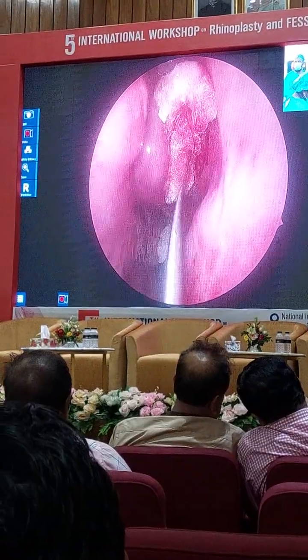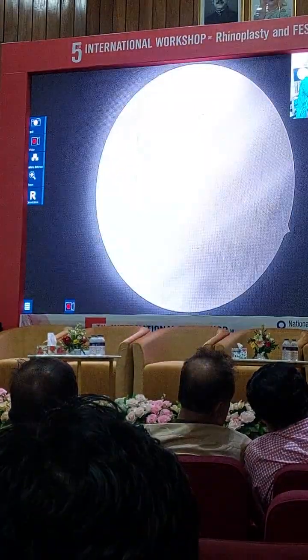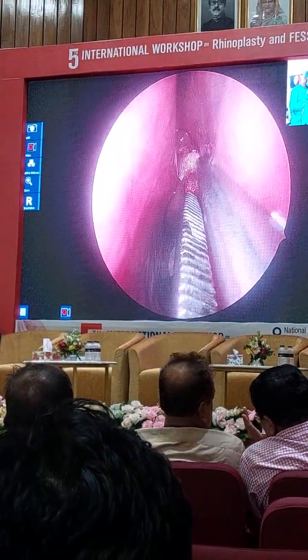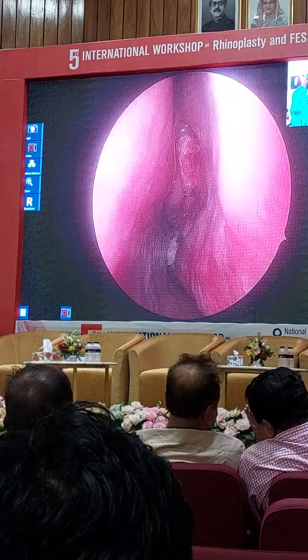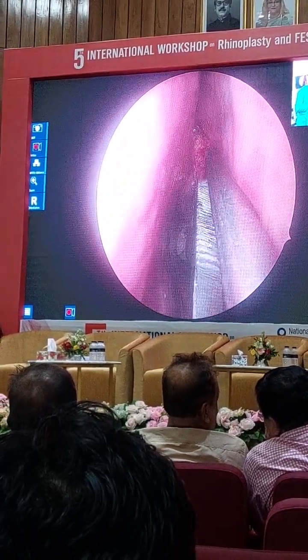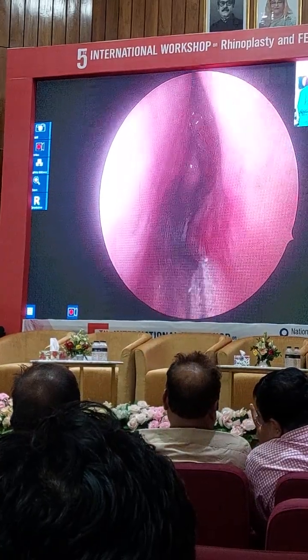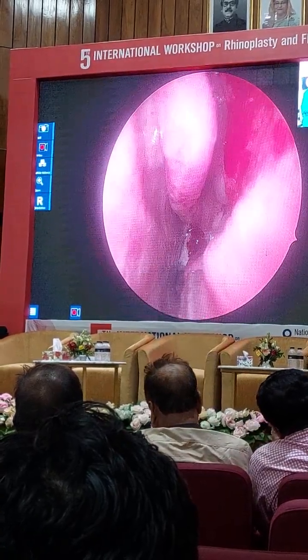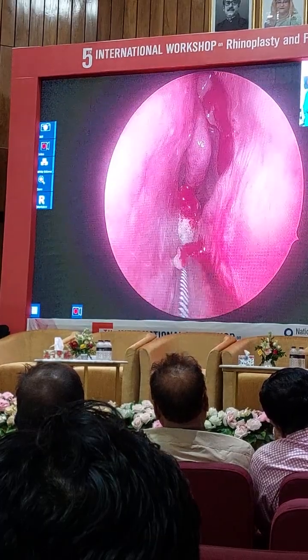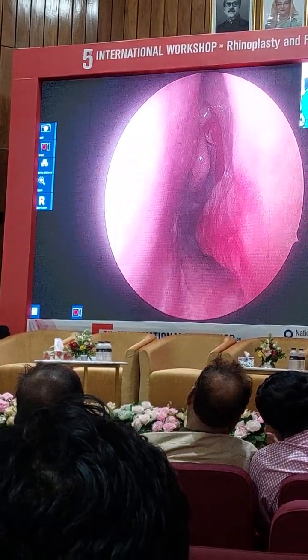Okay? So now we can take it out and see what we have. Sorry. Got many pieces here. So the right material for making these patties is actually soft roll. What the orthopedic guys use under the plaster. We make it from soft roll, so it doesn't break like this.